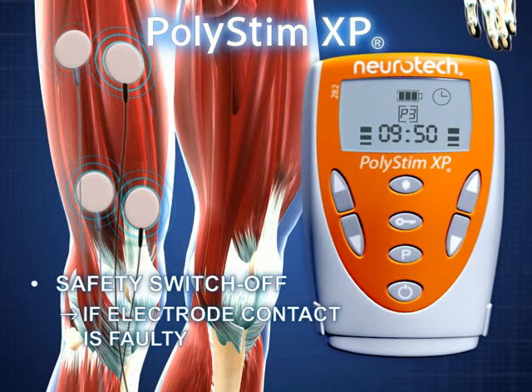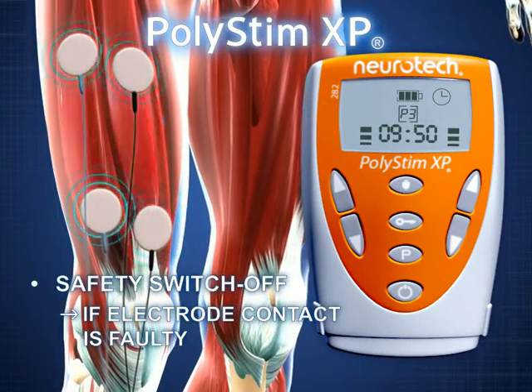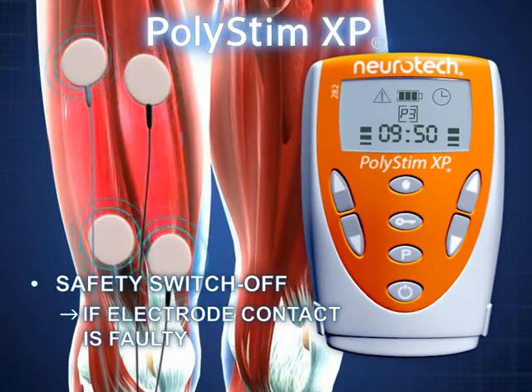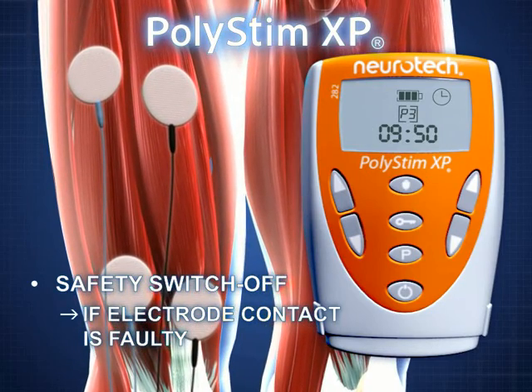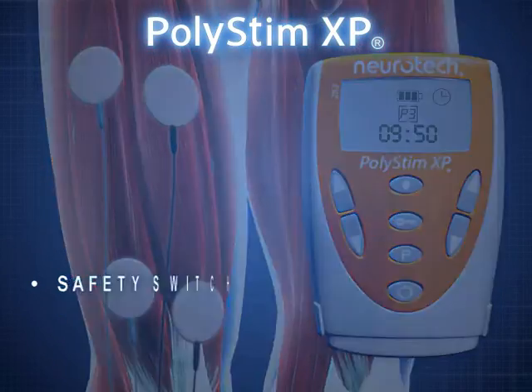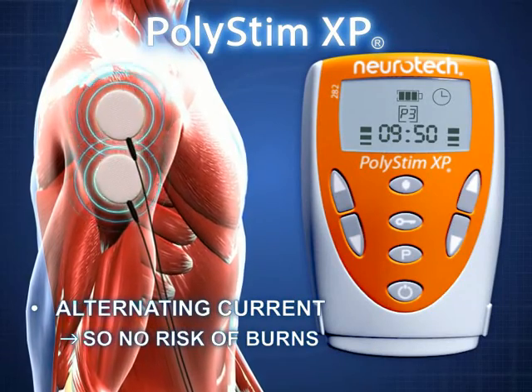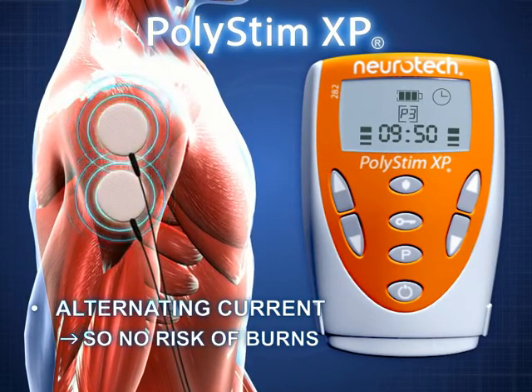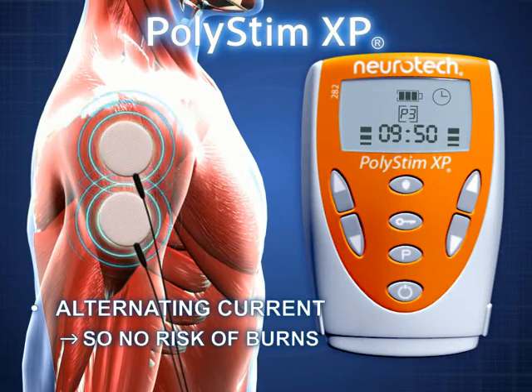The Polystim XP possesses a load sense function. If the connection between cable, electrode and user is faulty, the device gives a visible and audible warning. At the same time, the current is reduced. The Polystim XP uses alternating current, which avoids the possible skin irritations that can occur with direct current.